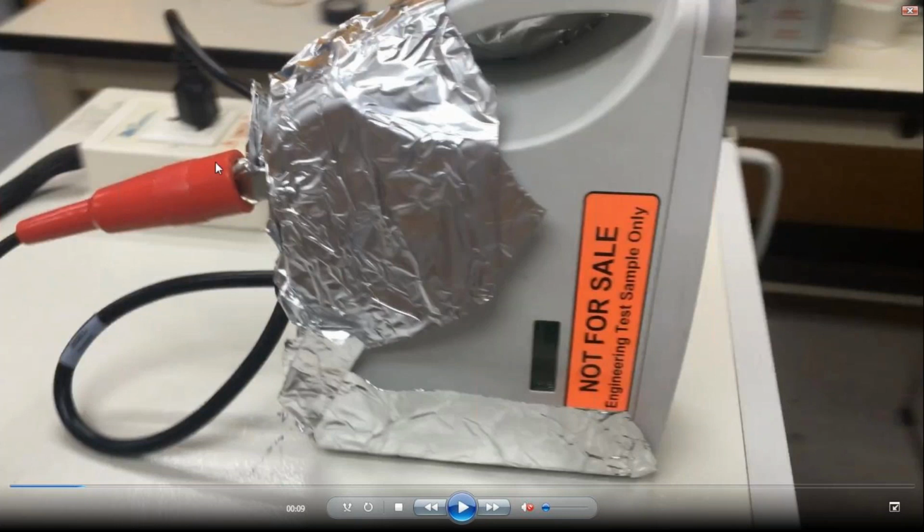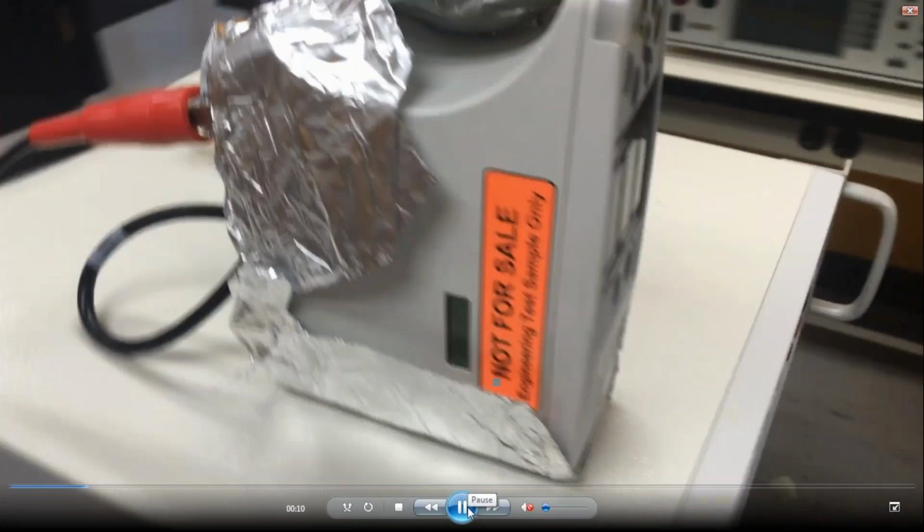So that's why you have a connection being made. This connection goes to what we call the probe high lead of our instrument, and it's connected to a conductive aluminum foil, which covers the majority of the area that may leak the current. Now, the standards also ask that you put the aluminum foil at the highest leakage point that your device may experience. So if you have a point where you know it leaks 60 microamps, and some points leak 10 microamps, you always want to perform your test at the 60 microamp points. Again, this is the medical device being connected.